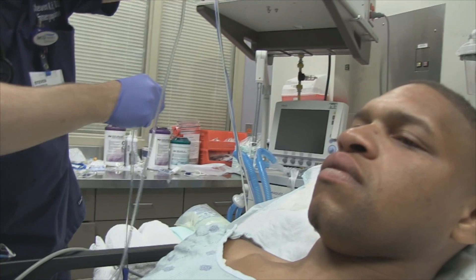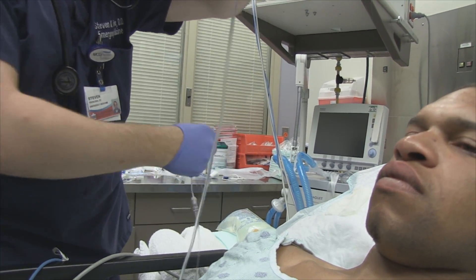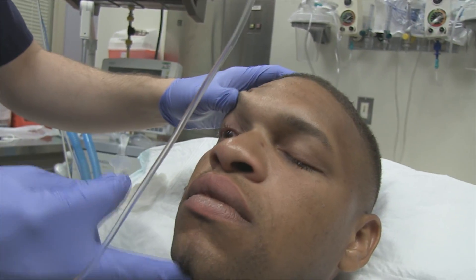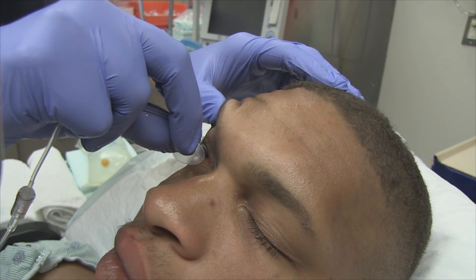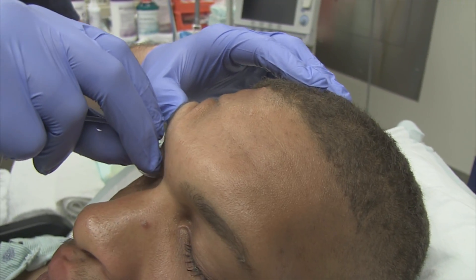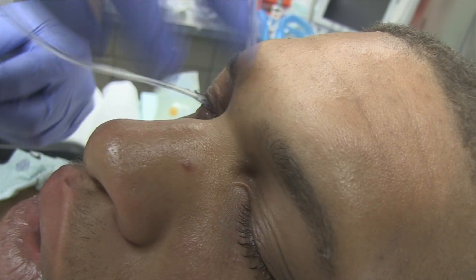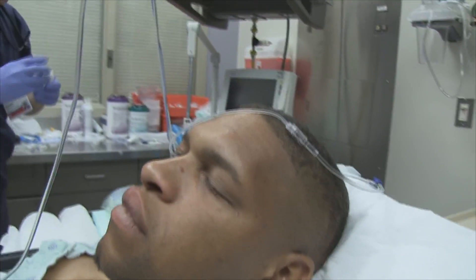You can run it at the highest rate the patient can tolerate — I'll start gentle for the placement. All I'm going to do is lift up your eyelid. Look down, keep your head up, and look toward the ground. We're sitting this in here like a little contact — slide it under the upper lid, then the lower lid, then look up. Close your eyes. Very good.